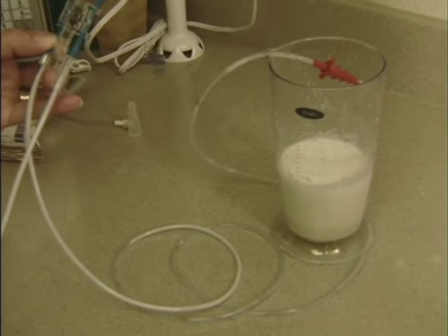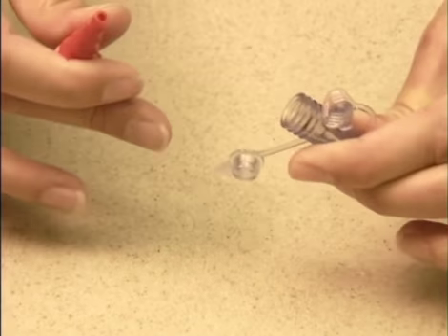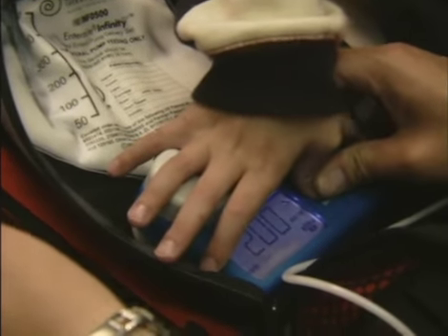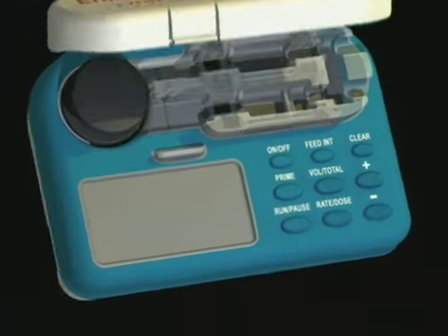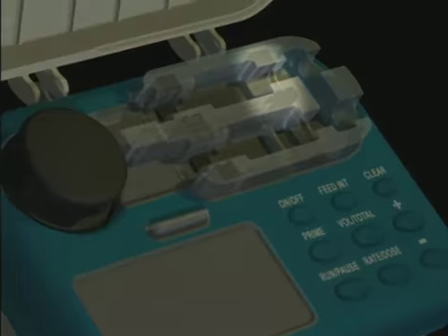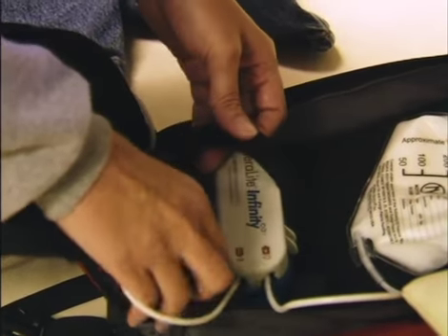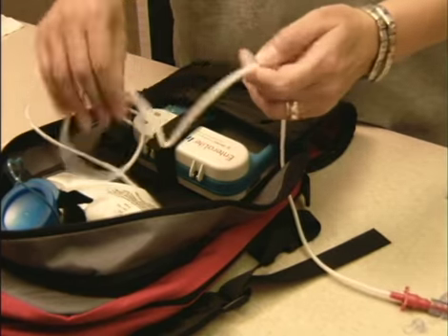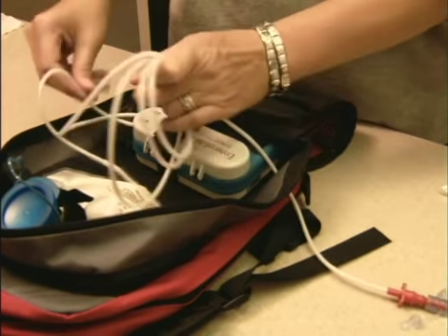If the bag is full but air is in the tubing, first detach the adapter from the user's enteral feeding tube. Then press and hold the prime key until the air bubbles have moved past the pump and to the end of the tubing. Check the cassette receptacle for cleanliness, especially around the air sensor. Check that you are using only an EnteraLite Infinity disposable set, that it is loaded into the pump properly, and that the door is closed. Check the disposable set for worn tubing. If it is worn, replace it with a new set.